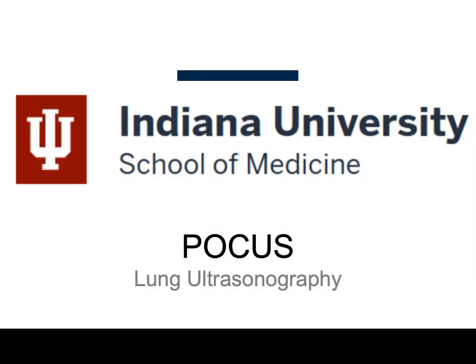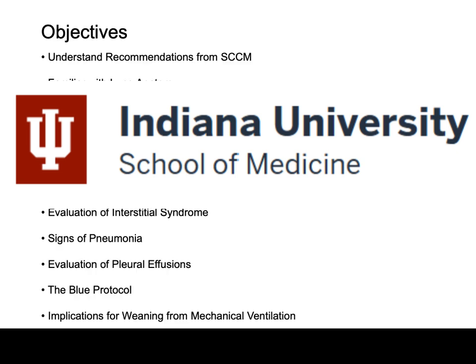Welcome to the Point of Care Ultrasound curriculum for the Internal Medicine Residency Program. This presentation is going to focus on lung ultrasonography.